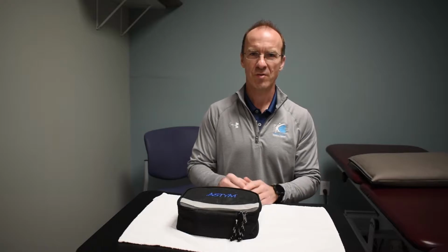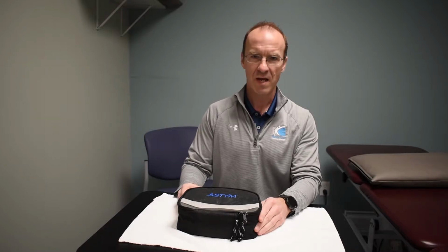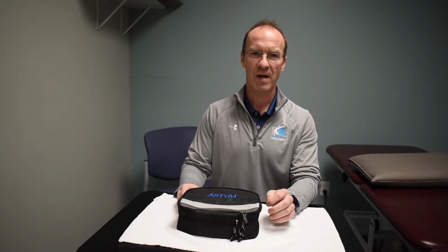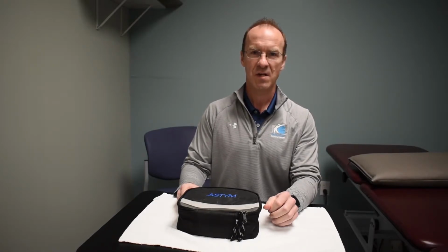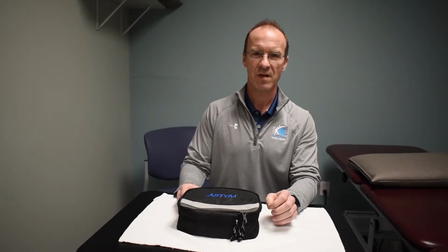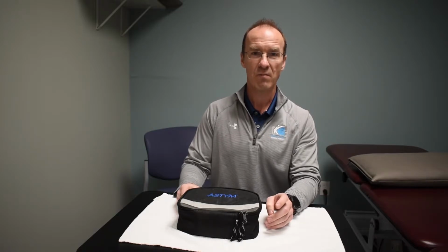We thought we'd introduce to you the different types of techniques for soft tissue massage today, specifically using something called Astym. Astym is a tool-assisted soft tissue massage geared towards working with injuries from people that have maybe got scar tissue following a surgery, maybe somebody has tendonitis of the knee, the elbow, plantar fascia, the Achilles tendon, all these areas that people kind of have these chronic aches and pains, as well as treating overuse type injuries. So people like an athlete or someone who has a job that has a lot of repetitive movements and maybe they're starting to notice some aches and pains.